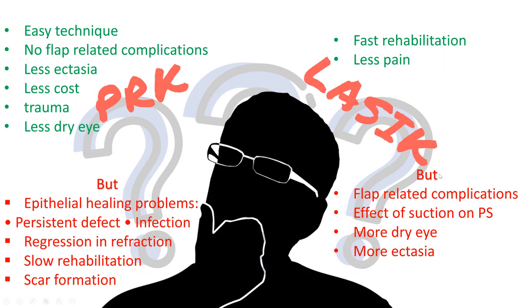Now for the complications of LASIK. As I mentioned, there is a long list of flap complications. As I told you, the striae, the incomplete cut, the buttonhole, the free cap, the diffuse lamellar keratitis, all these can occur with the flap.